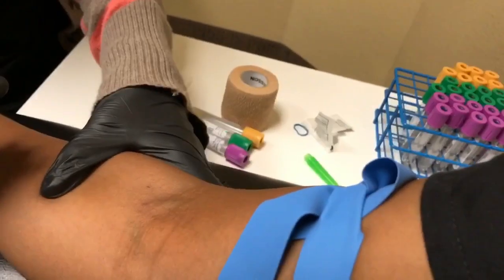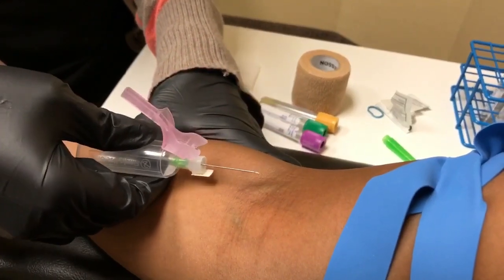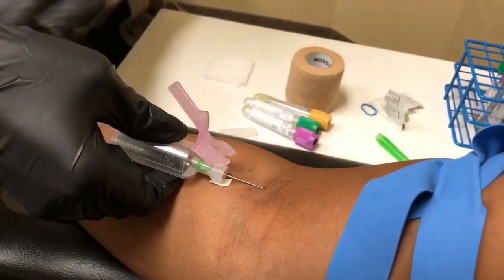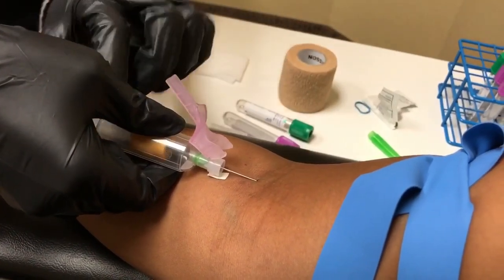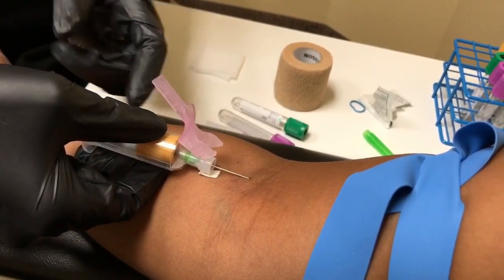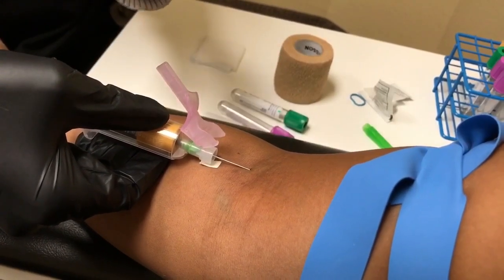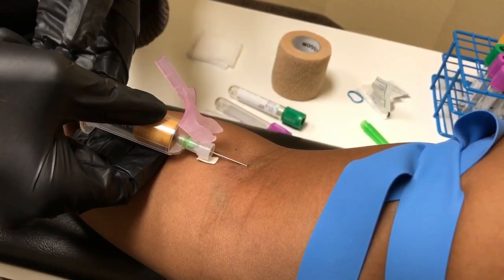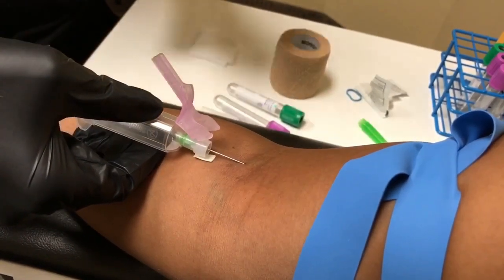You're going to want to pull back on the skin so that you're anchoring that vein. I always tell the patient you're going to feel a little pinch. You can relax your fist. First tube. Take advantage of the little feet that are on the hub and pull back on them as you're pushing in, because you want to keep the needle as steady as possible. This is going to ensure that your patient doesn't feel a lot of pain.